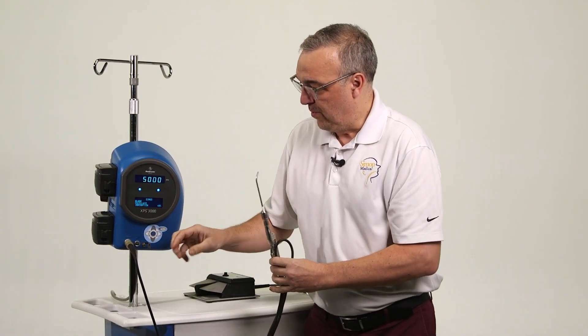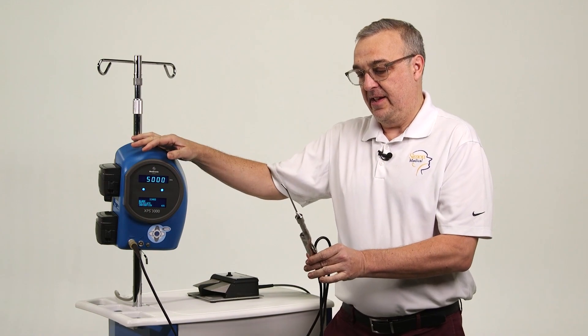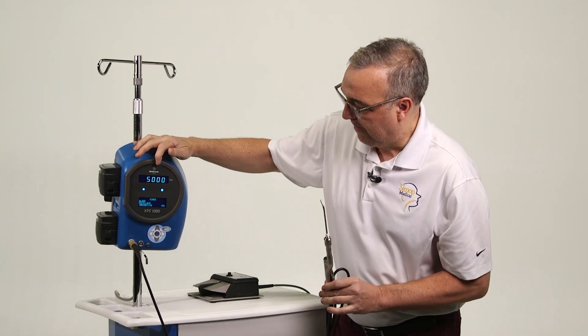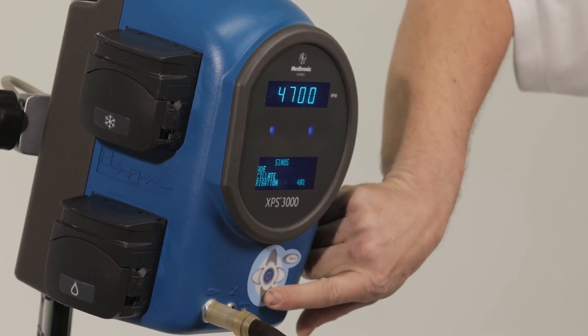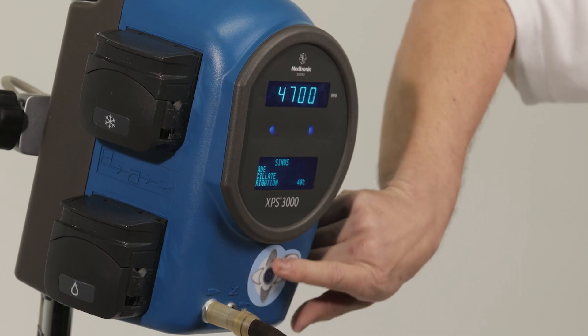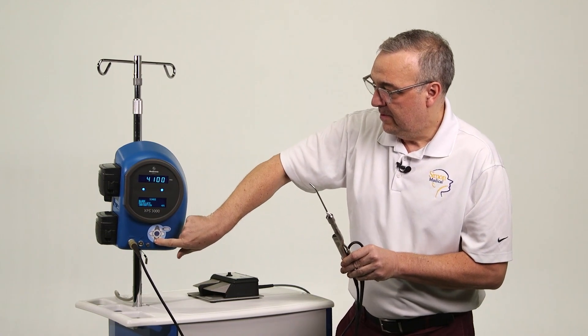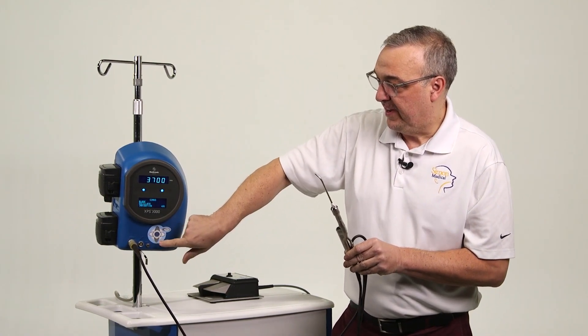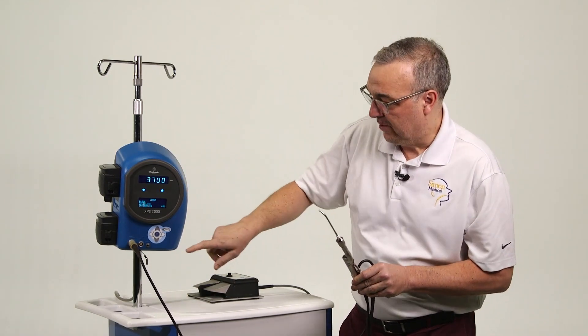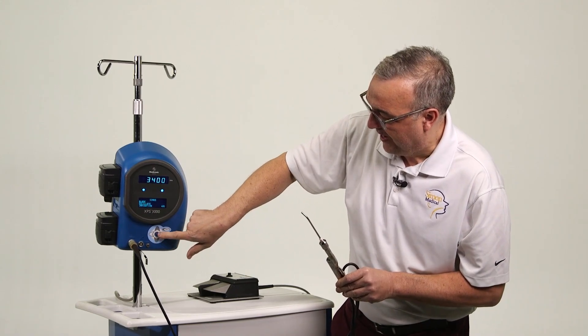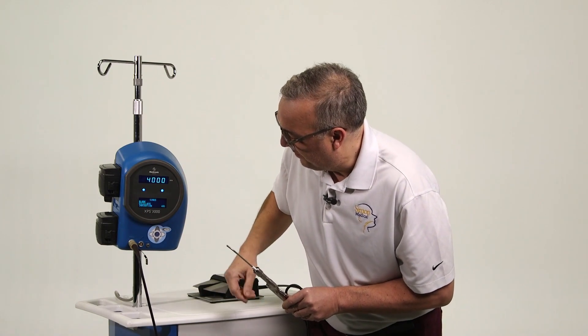Now when we're plugged in, it will go to the default settings. So the default settings with the M2 microdebreeder are 5000 oscillate. If you want to turn that down, we can simply do that manually with the up and down arrow. So if your surgeon wants to use 3000 because some will, if they used the older boxes, the max speed was 3000. So some may be more comfortable at 3000. So you can simply adjust that manually with your fingers, take it back up to 5000, and it's in oscillate.